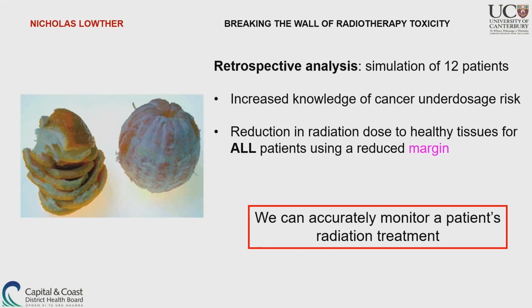So if they are at risk of a cancer underdosage or at risk of a healthy tissue overdosage, we're able to flag their treatment and make a change during their treatment. And that's my software tool for breaking the wall of radiotherapy toxicity.